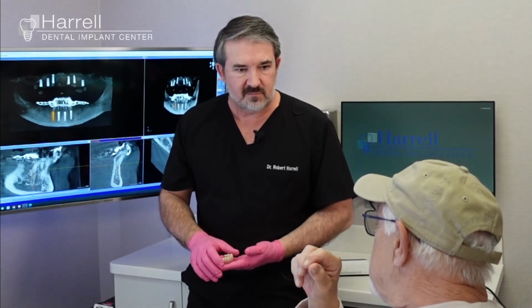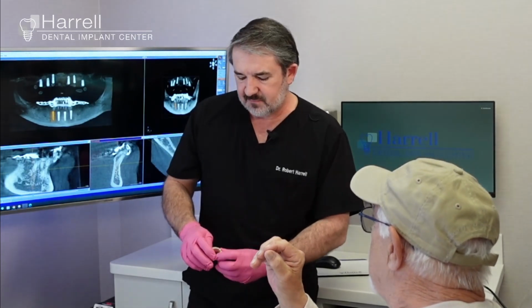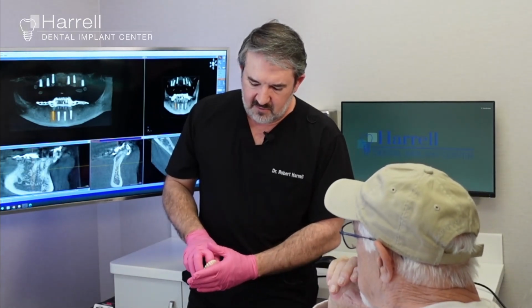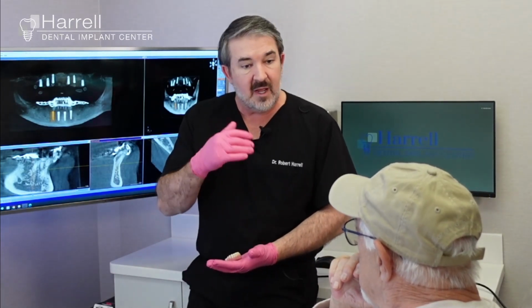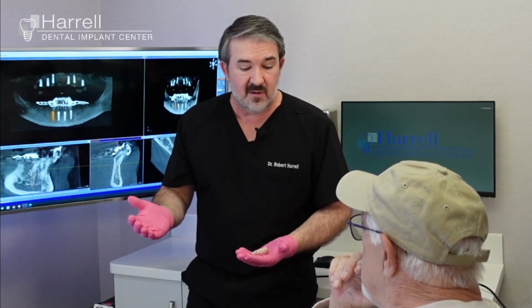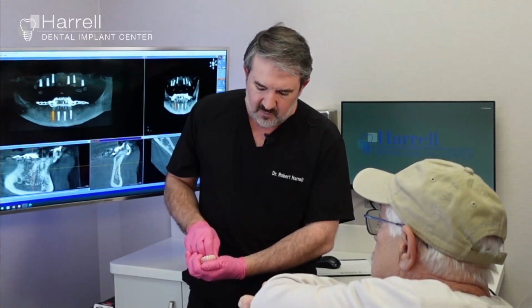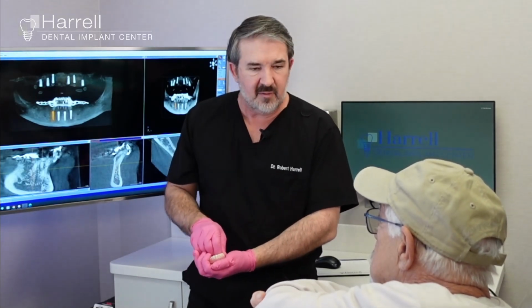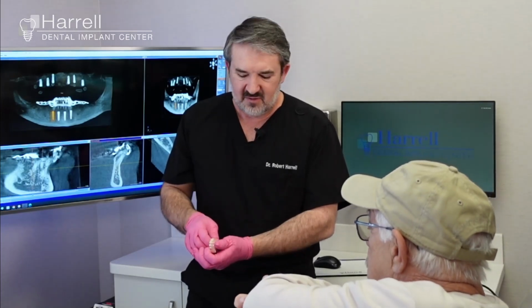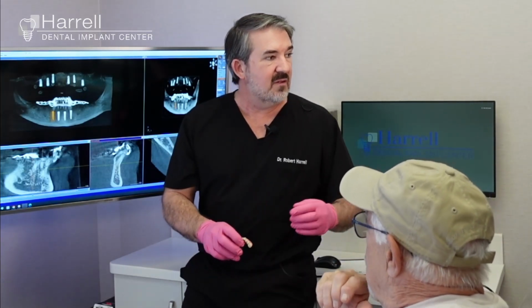Well, I was just thinking, it just seems like a lot of gum. Well, gum on top of gum. This one is different. It really varies based on your anatomy, the size of your jaws, how big your mouth is. So this one probably looks like more gum. Most patients, you're probably going to see something like that. Okay, that makes sense. Yeah, this was a kind of a big guy, and he'd lost a bunch of teeth. Right. Was that a provisional set?